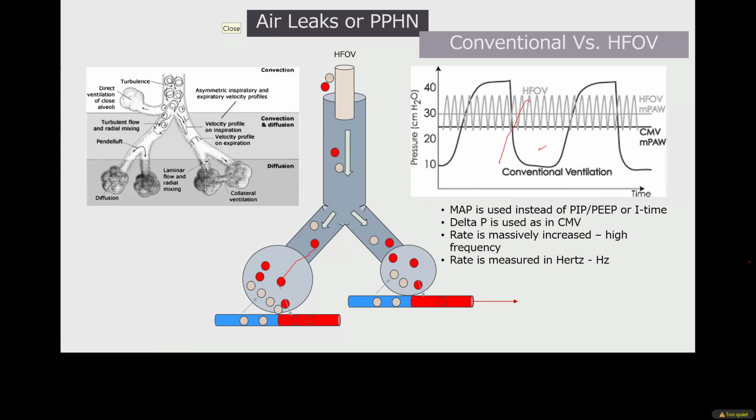So it's really a great strategy, when you have a high CO2, to get rid of the CO2 because there's an active exhalation. By various mechanisms, high frequency ventilation provides oxygen to the baby and gets the CO2 out, and causes very little volume trauma because the oscillations are very small volumes going at a time.